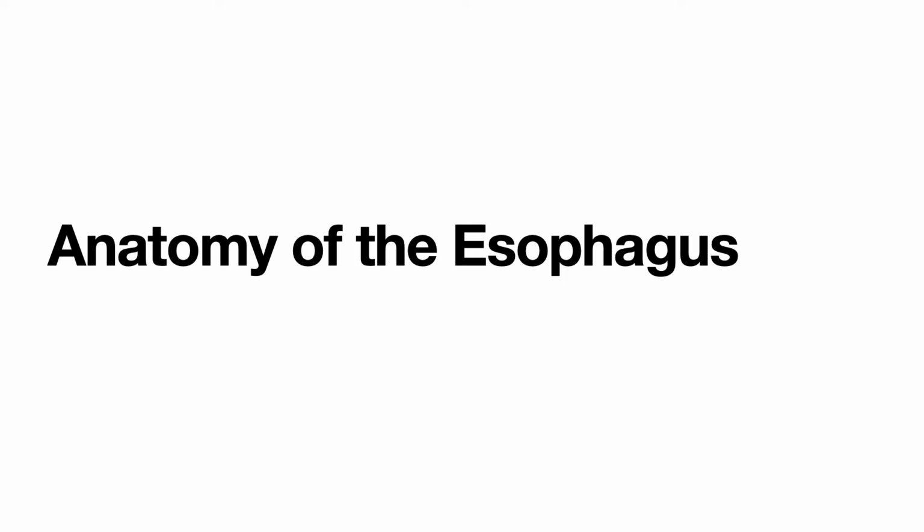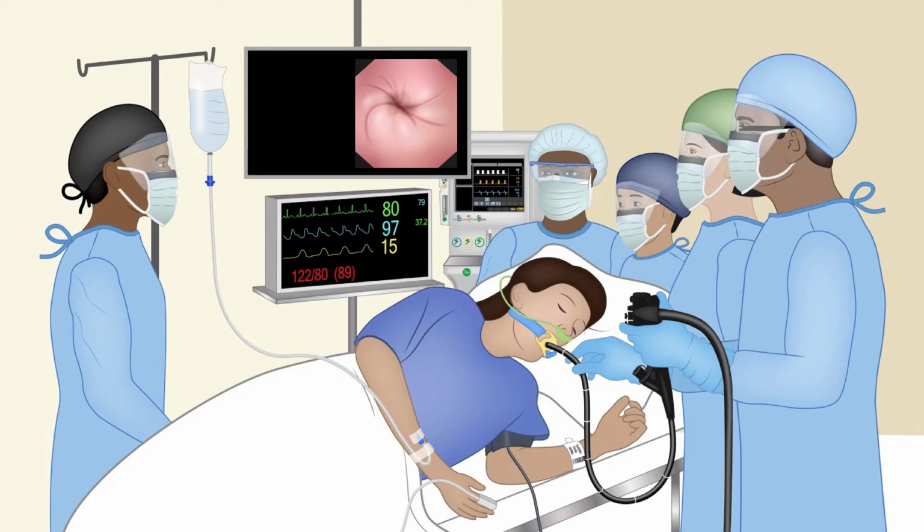Let us review the anatomy of the esophagus that is relevant to endoscopy technicians, nurses, and trainees. So here is a woman who came in with acid reflux and heartburn, and we are performing an endoscopy. The endoscope is in the esophagus at the lower end, looking at the lining. So as we do this case, let us learn about the anatomy that is relevant to the esophagus.